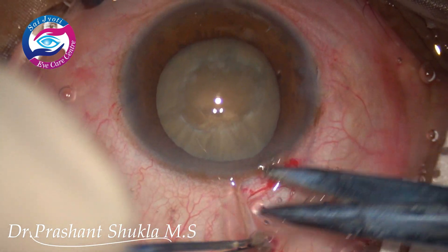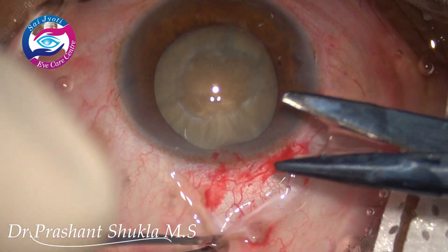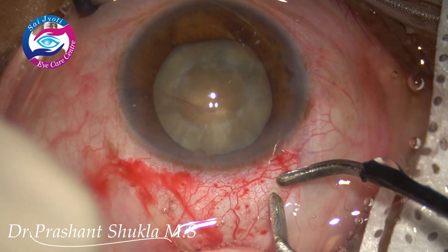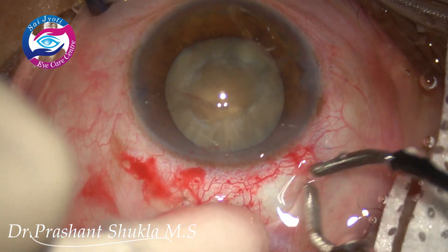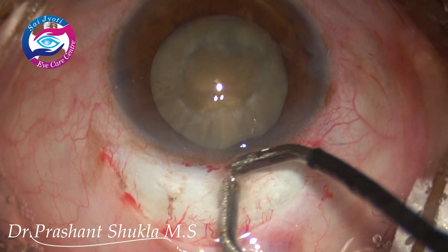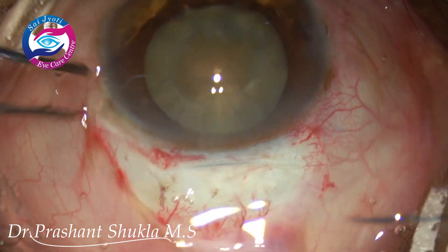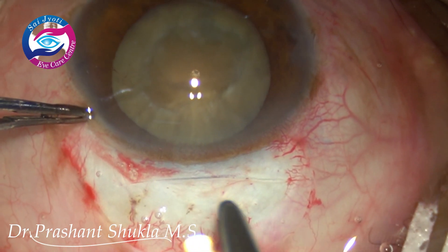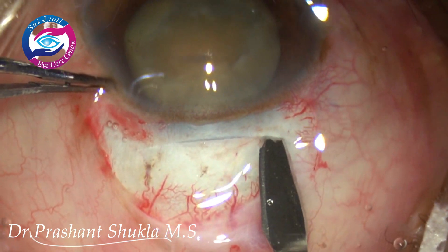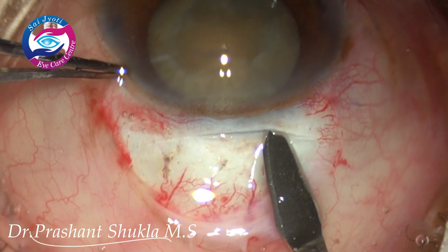Now is the time to make the scleral flap. Minimal cautery is done to clear out all the bleeding vessels. A half to one-third thickness, frown-shaped scleral incision is made. Now with the help of a crescent blade, the ends of the incision are being marked. We are not entering the tunnel yet — we are just localizing the incision ends.